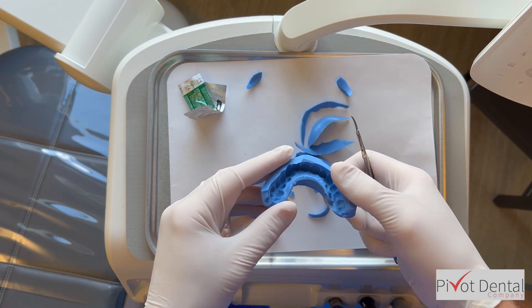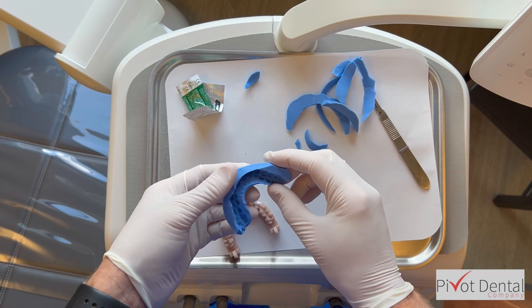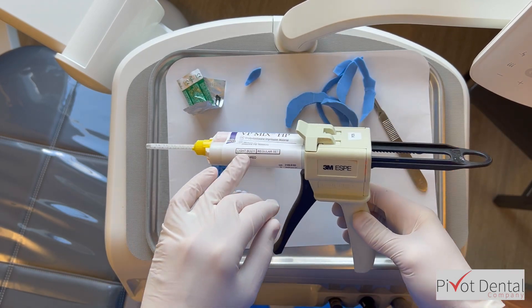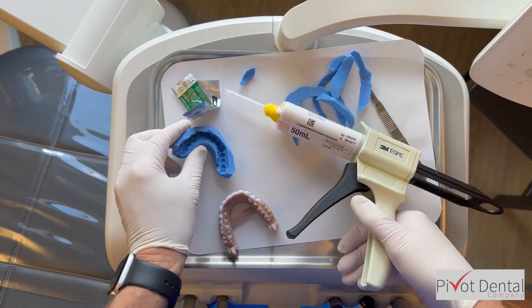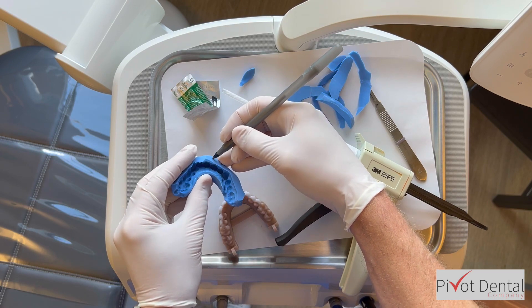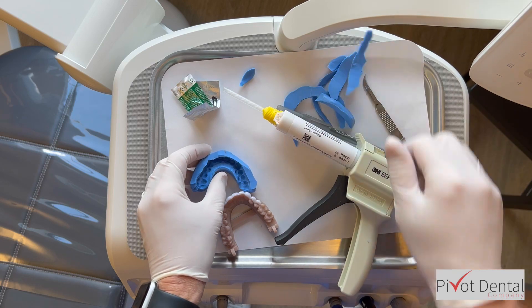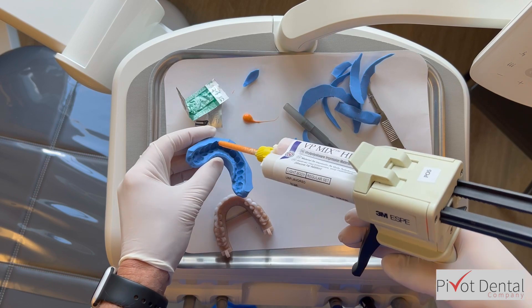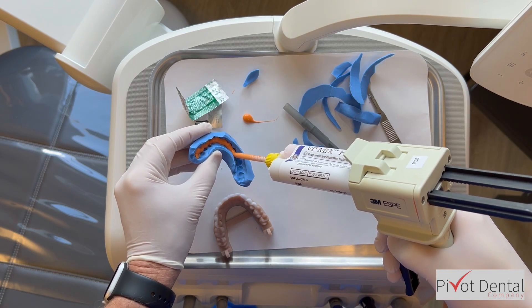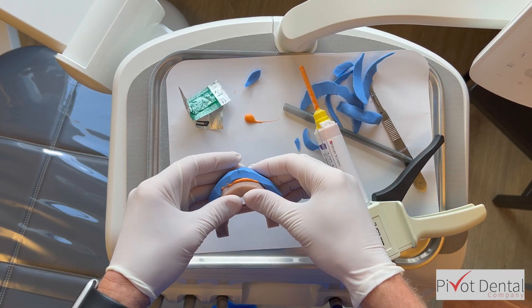Once trimming is done, I'm going to put light body PVS material into the impression. But first I take a pen and mark right between teeth 8 and 9. I do this with all these cases because when you try to insert the putty onto the model or especially in the patient's mouth, it can be difficult to line up left and right. Following that 8-and-9 mark makes it much more predictable. I fill the internal of the matrix about 75% full with light body material.